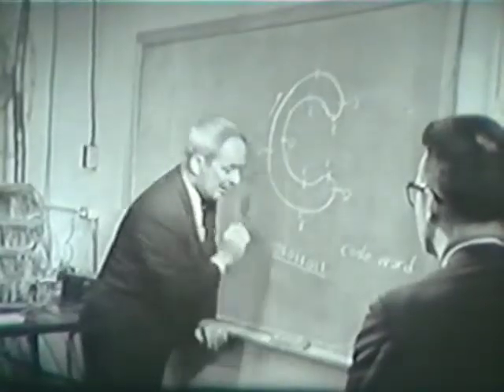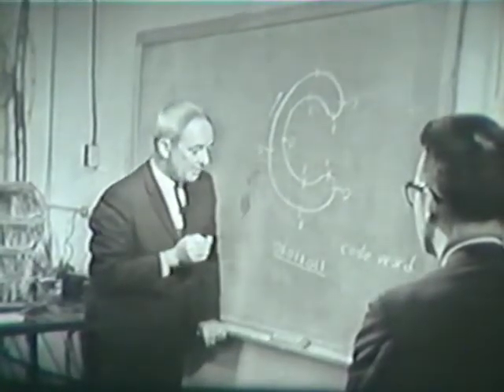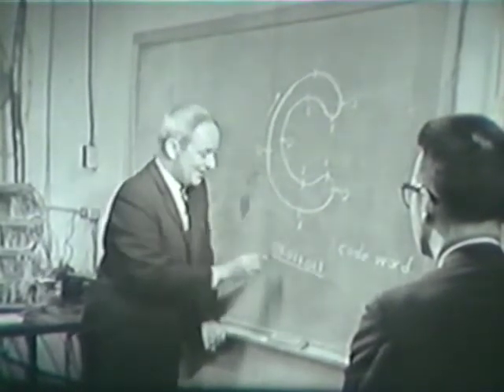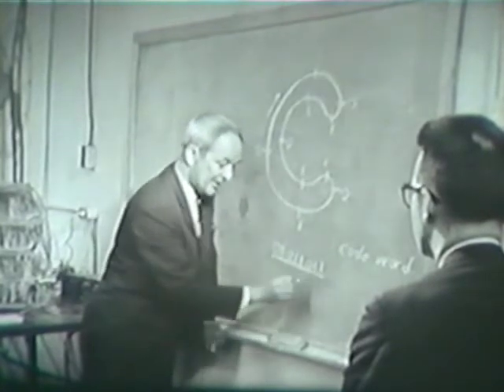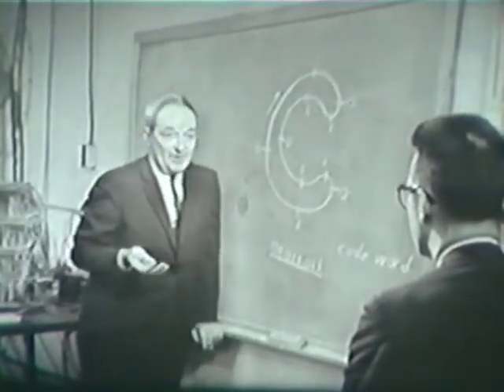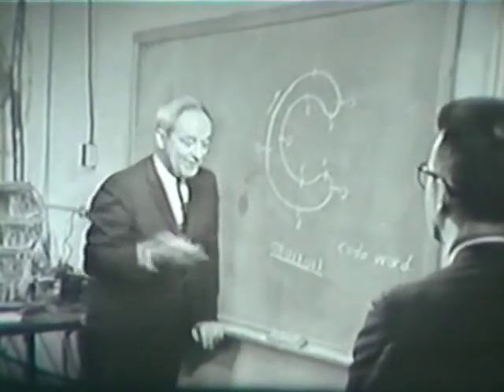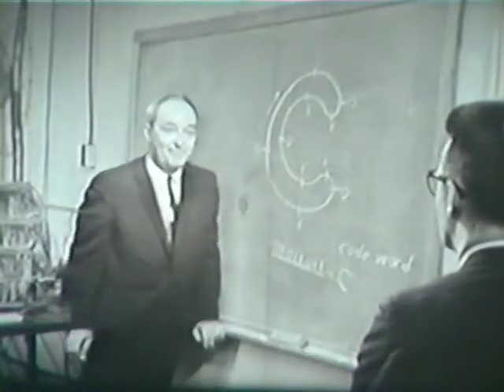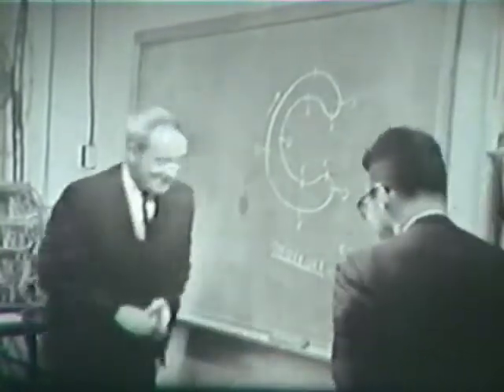And so what happens, as we'll see in a moment, is you have to train a computer. You have to let it look at a letter, and then the computer tells you that it picked up a certain code word, but it says, I don't know what it is. And you tell it. You type on the typewriter over there, C, and from then on it knows that this is C. It puts a C by it. Oh, could we see that work? Yeah, we keep going that way. Fine.